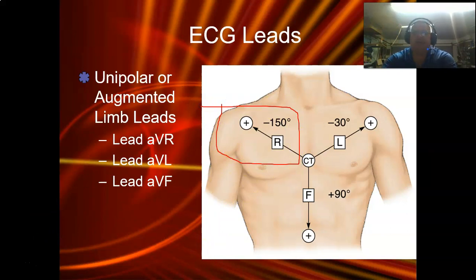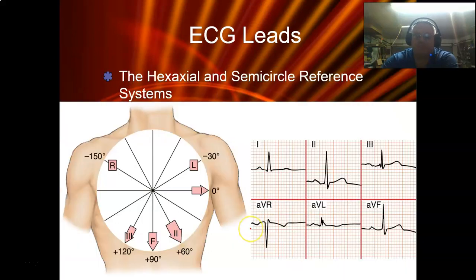There is a very specific case where we will look at it, and I'll explain that as we get into it. But for the most part, very rarely do we actually use AVR to read anything. We're going to use this one and this one a whole lot, actually.